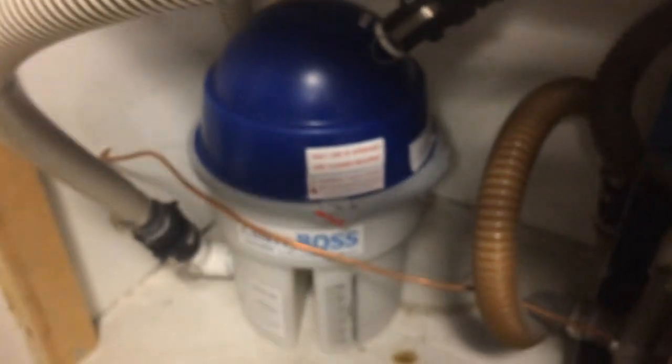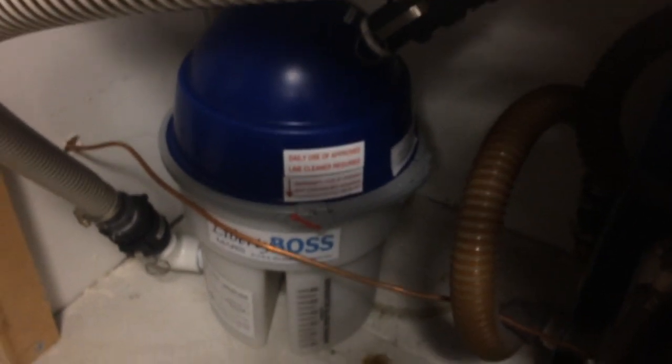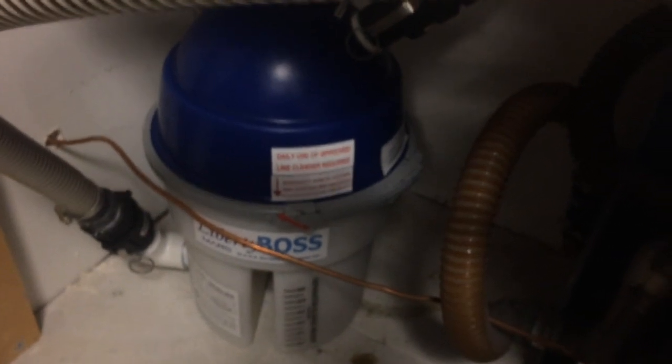This is what an installation of an amalgam separator looks like when it's done by a certified amalgam separator specialist, instead of a plumber or just a standard technician.